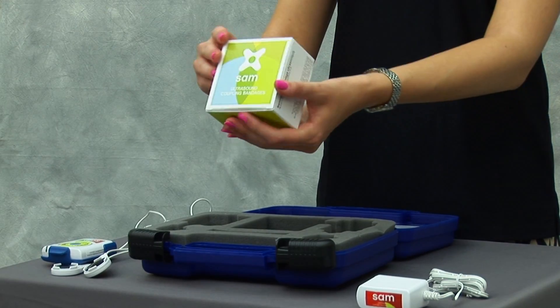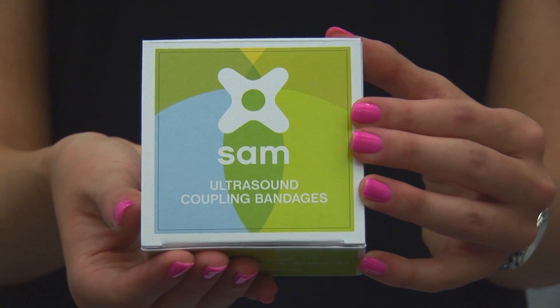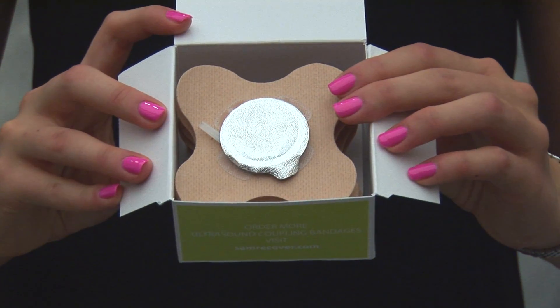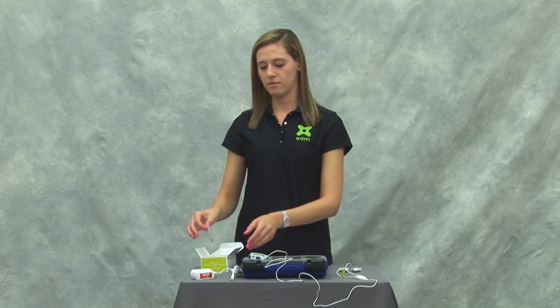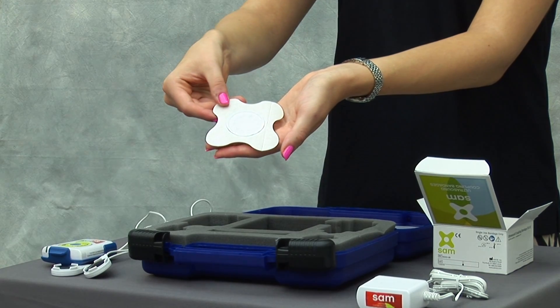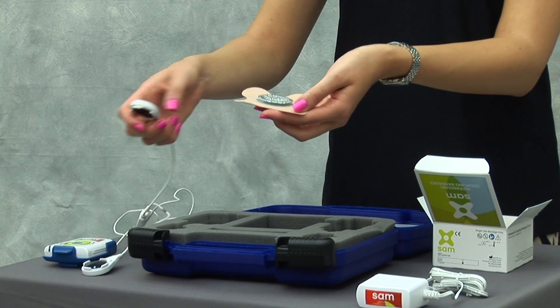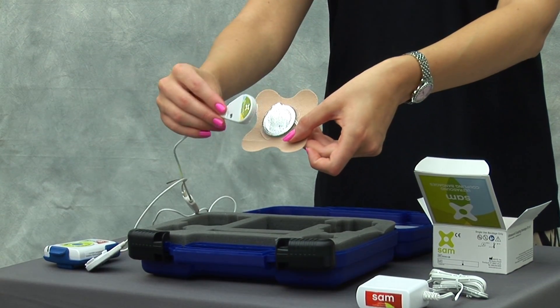Each kit also comes with 10 ultrasound coupling bandages. To use the bandages, remove the top foil and snap the applicators into each of the bandages to deliver continuous ultrasound therapy.